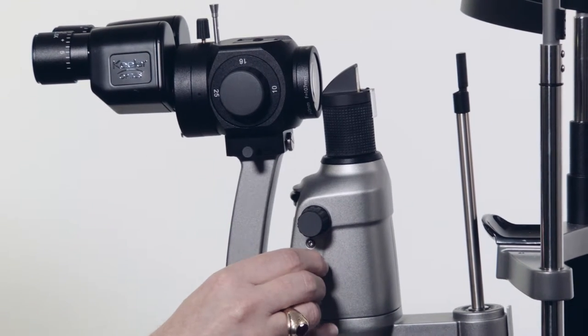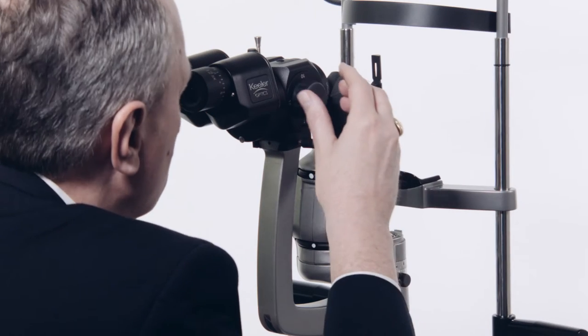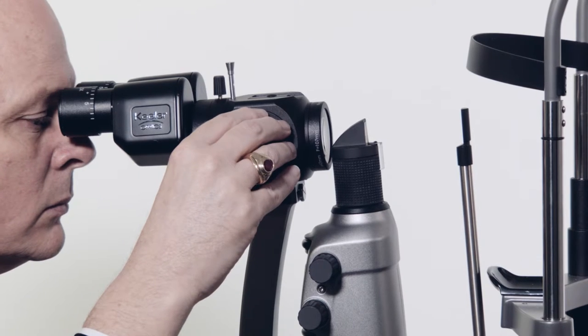Adjust the slit width using this adjuster. Slit width ranges from 1 to 14mm. Magnification is adjusted using the 3- or 5-step drum here.